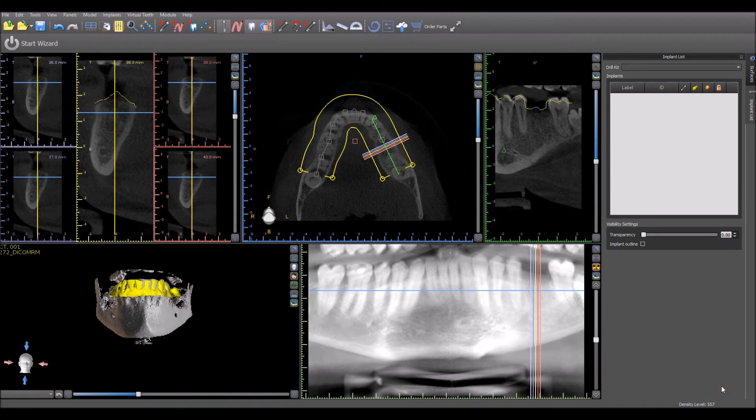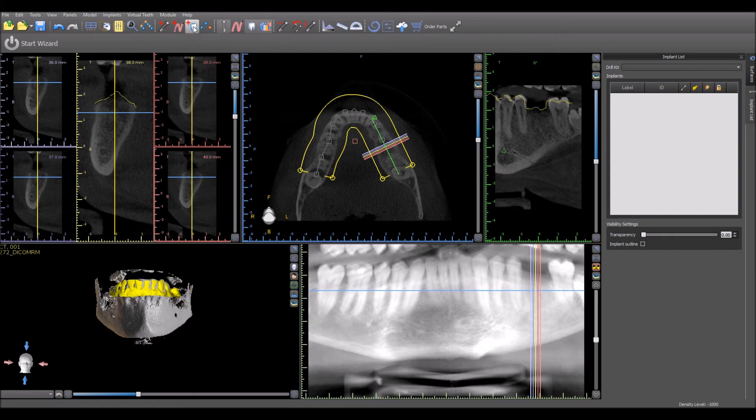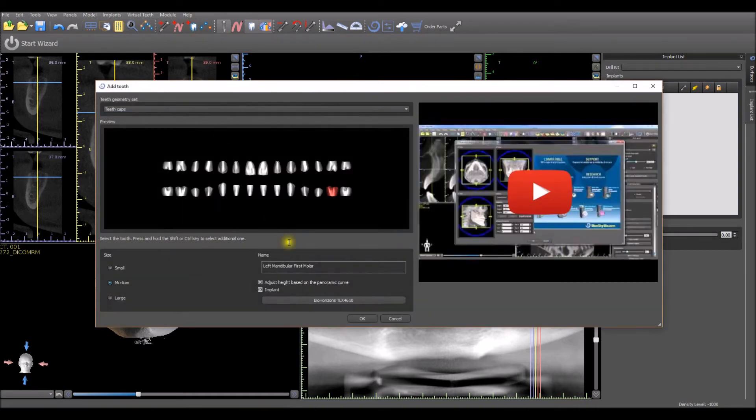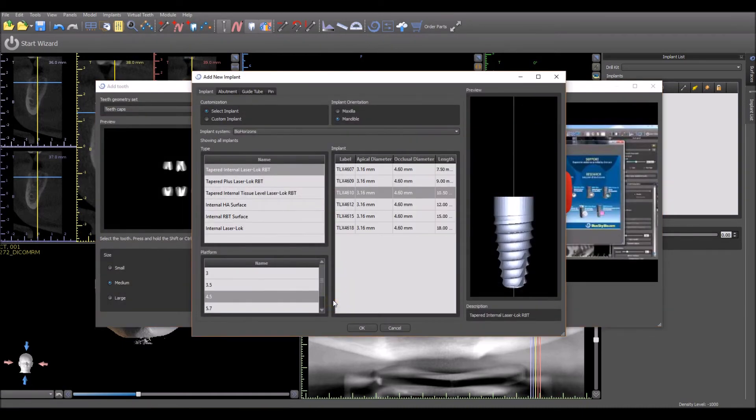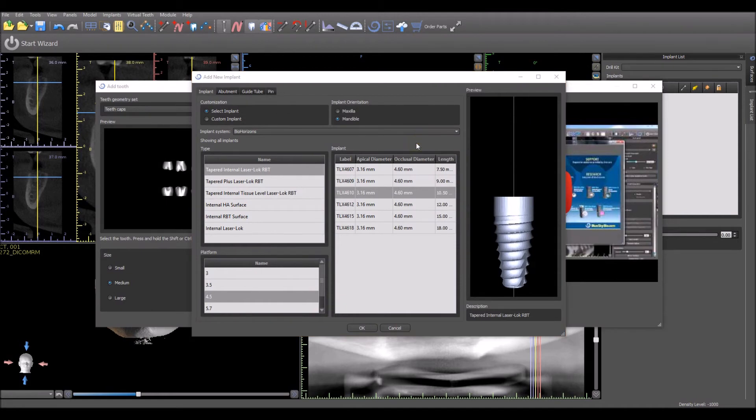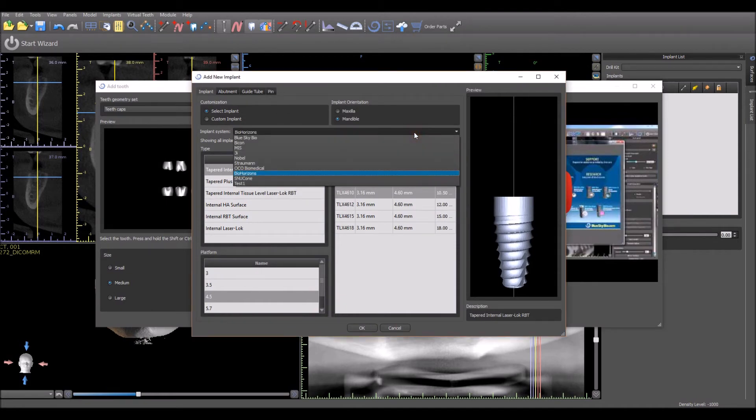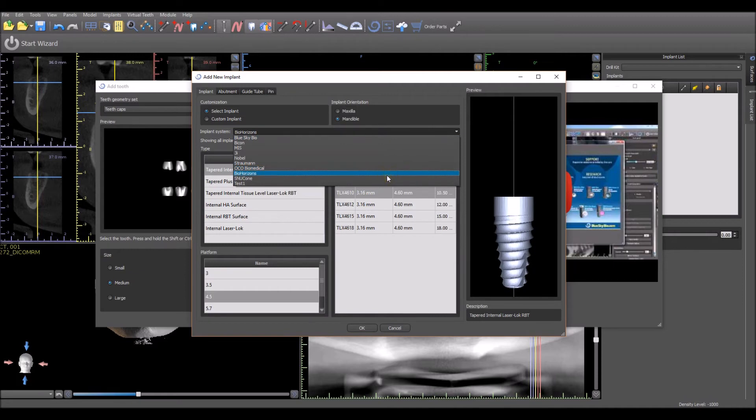In the normal mode, press the add implant button or choose to add a virtual tooth together with an implant. Press the implant systems drop down menu to select the relevant implant system of the implant that will be placed.